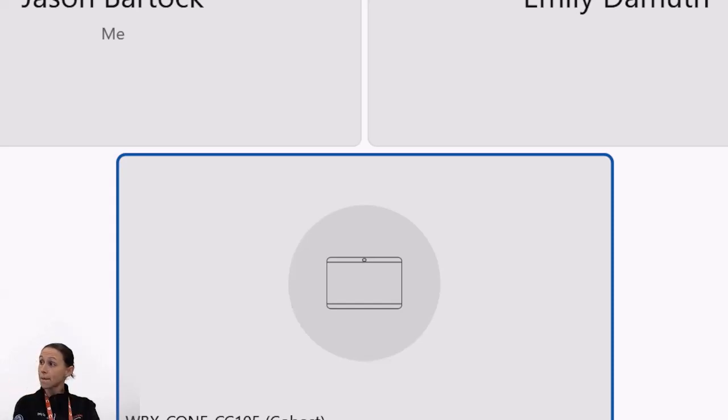Yeah, so VAV, for those unfamiliar, right? We have one drainage. We're draining from the venous side, and we're putting oxygenated blood back into the venous side and the arterial side. So there are 2 scenarios where you can think about that. One is a patient, like Dr. Davis was saying, who's on VV, and now they have cardiac dysfunction, whether the right heart or the left heart.